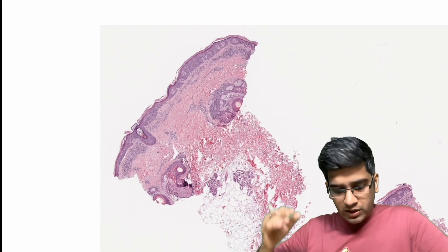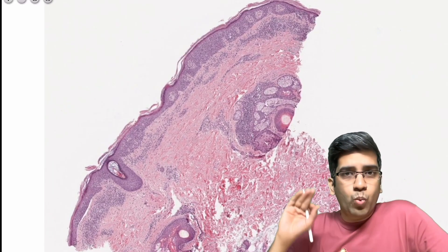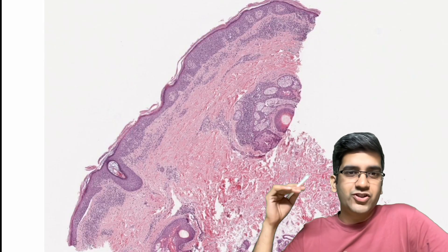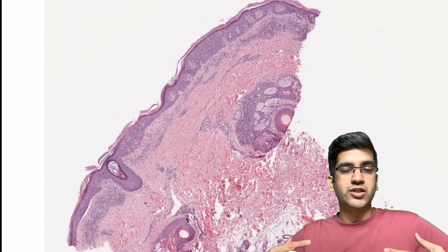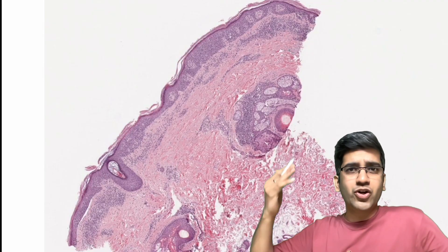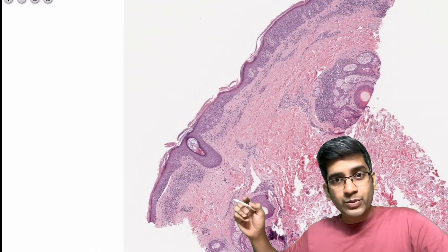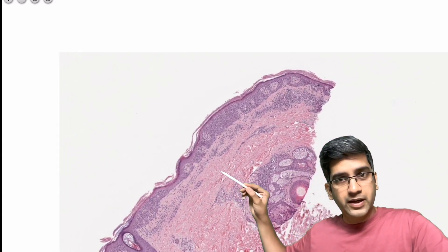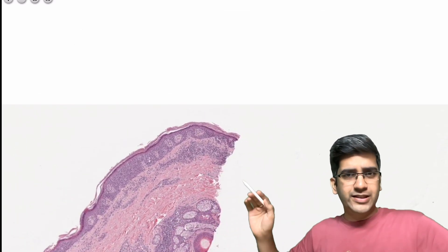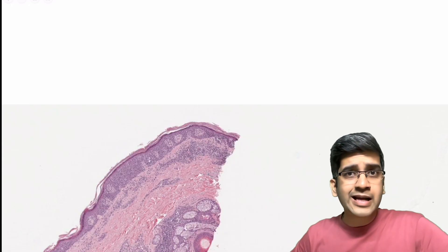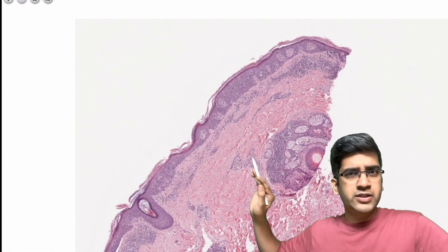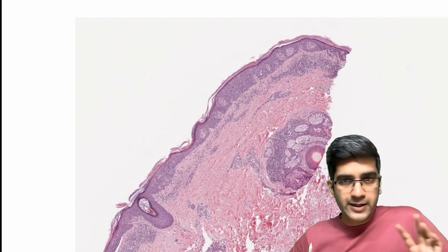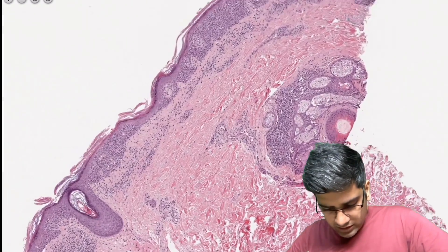Now let's go into the image. Even at this power, what you can appreciate is a more or less fine epidermis — not having very gross papillomatosis, hyperplasia, acanthosis, or keratinization. One thing which is very prominent even at this power is a good amount of sparse to dense inflammatory infiltrate in the superficial papillary dermis area.